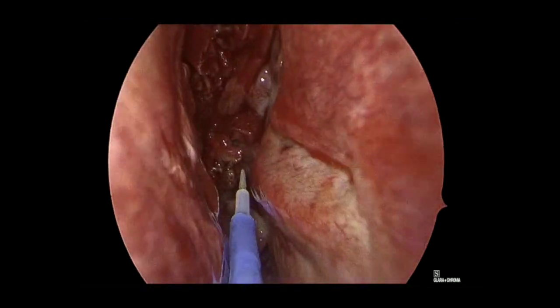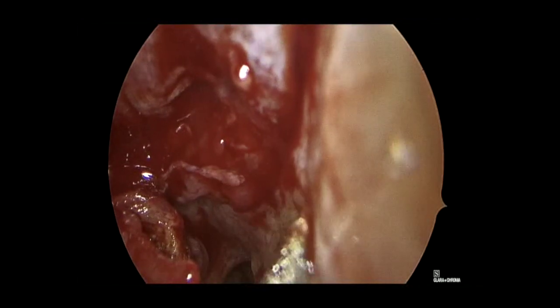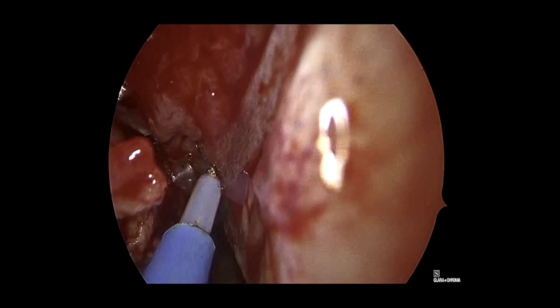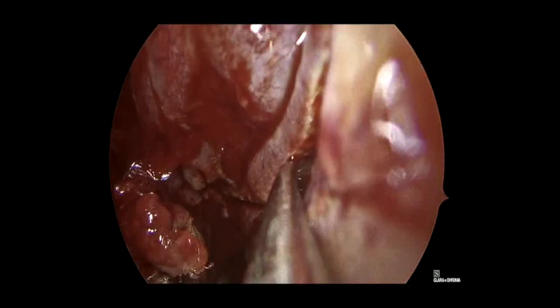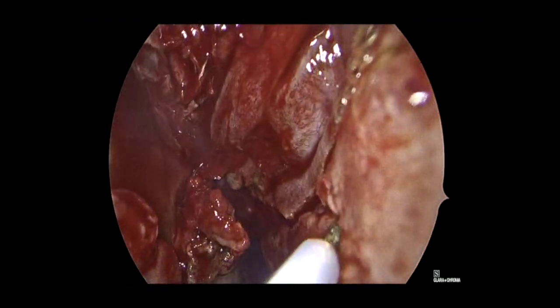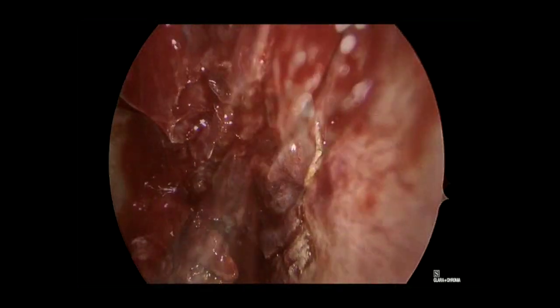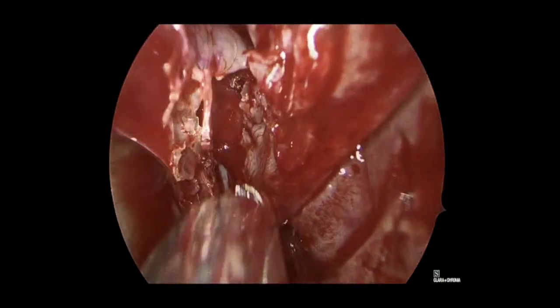The tumor is more involved on the left than the right side, but there is some tumor involving the right nasal septum. As we begin to delineate a potential flap for reconstruction, we will make incisions with a needle-tip bovie just below the flap, leaving a fairly narrow margin. We'll then raise this and take margins from the flap. This will ensure there is no tumor contamination in the reconstruction at the end of the case. Reconstruction is very important, but the most important thing is an oncologic resection with negative margins — never compromise your oncologic resection just for a potential reconstructive option.